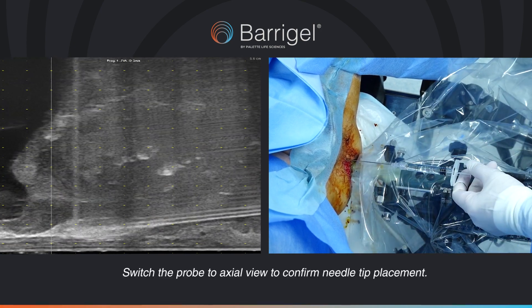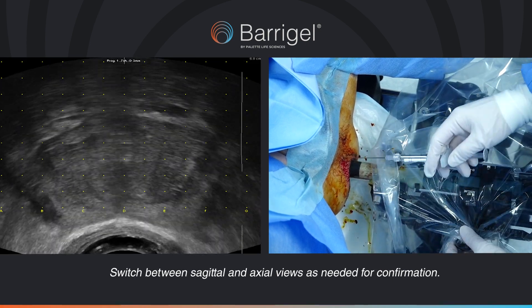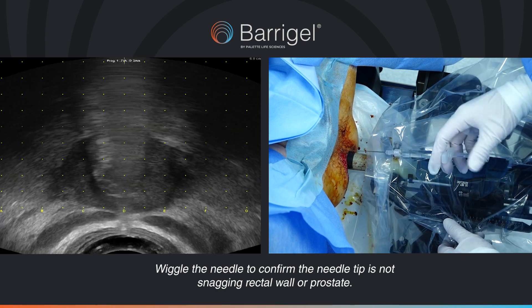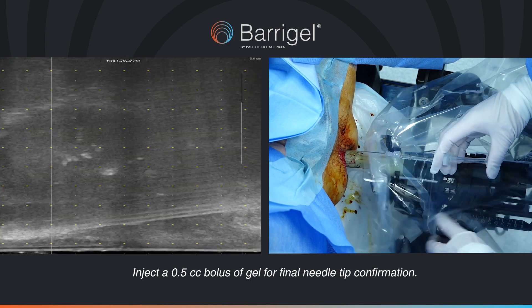Switch the probe to axial view to confirm needle tip placement. Switch between sagittal and axial as needed for confirmation. Wiggle the needle to confirm the needle tip is not snagging the rectal wall or prostate. Inject a 0.5 cc bolus of gel for final needle tip confirmation.